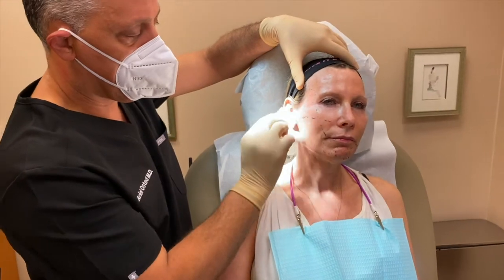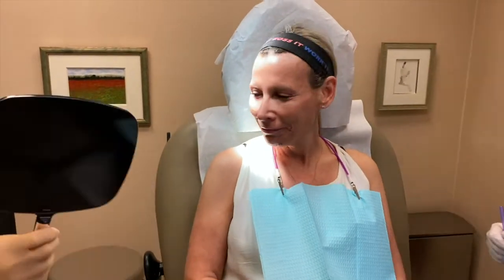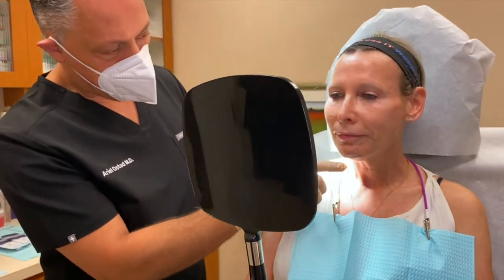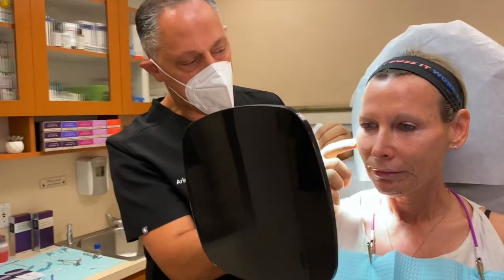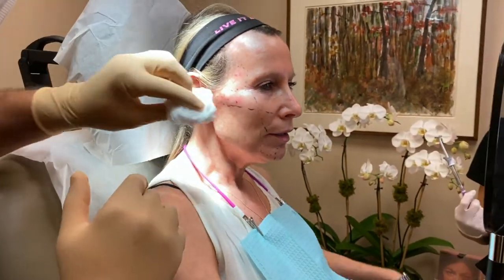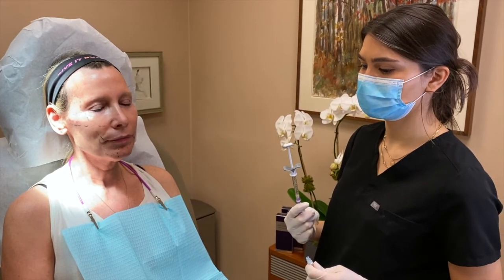Meanwhile, I'm just holding a little bit of pressure. Before we even do your mid-cheek, I want to show you how it's already improving without even doing your mid-cheek. Do you see how your jawline got better? Mm-hmm. You see how that sagging is better? And again, your temple is better, you have a little bit fuller cheekbone. Now we're going to address this location here. This is where you're kind of hollow. I can really see the difference from this side to this side. Looking beautiful, okay? Thank you. So I basically touched the mirror. Let me just change my gloves for a second.